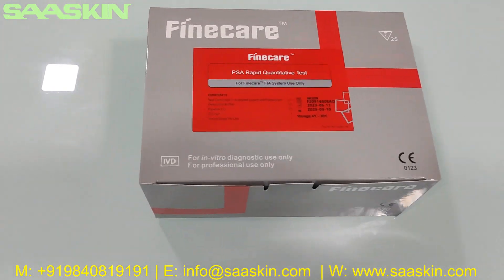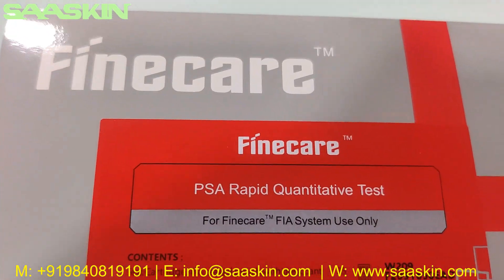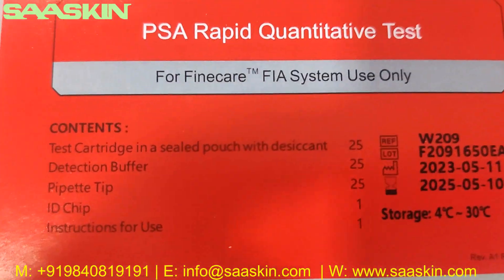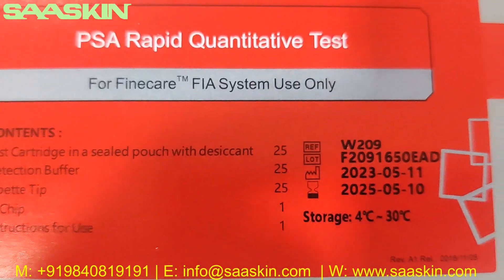Hello everybody, today we are going to see the unboxing of FineCare PSA Rapid quantitative test. This is to be used along with the FIA system only.